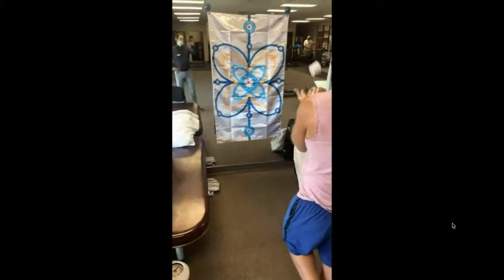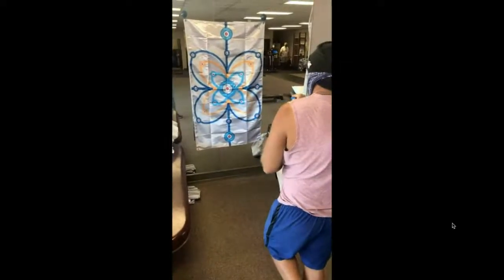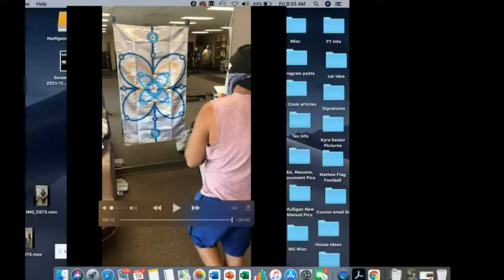So he has to give a little bit of a catch or a throw and catch on the left side there as he's moving through complex movement patterns on the right side. So really testing dual tasking in different forms of vestibular rehab here, where one side is doing some cerebellar priming, the other side is doing dual tasking, different areas of the brain, and then you also have it in single leg stance, reducing the base of support.